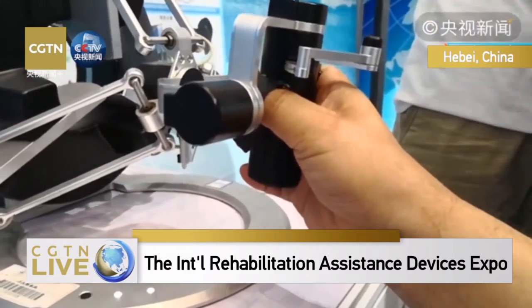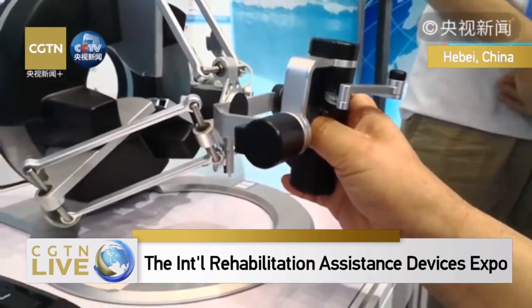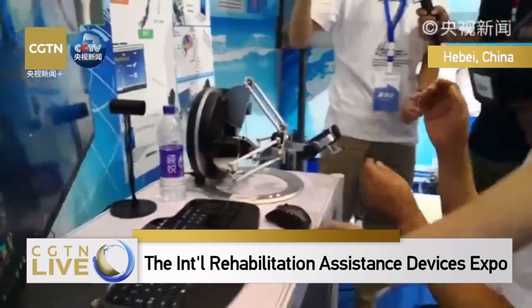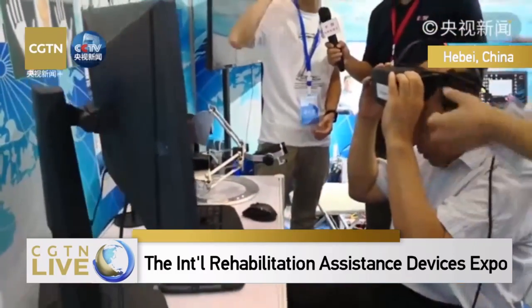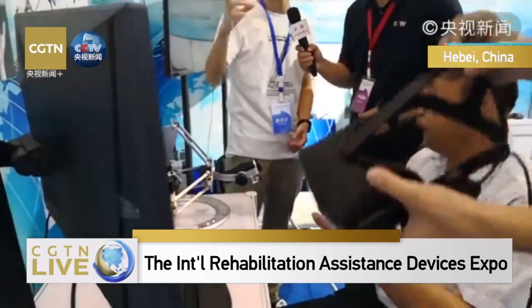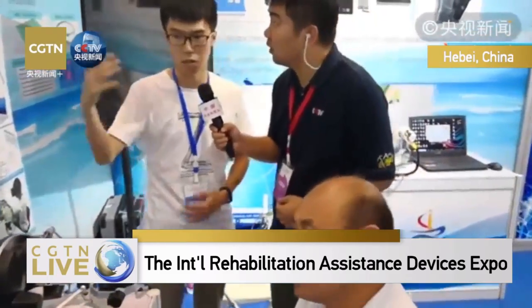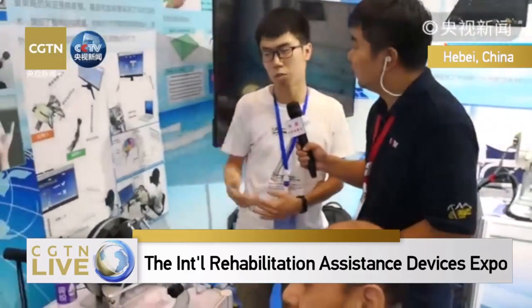We will have a series of statistics about the time and the mobility of the wrist and the flexibility of the wrist. It will only take a couple of seconds to complete the process.